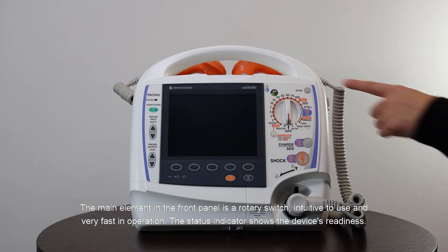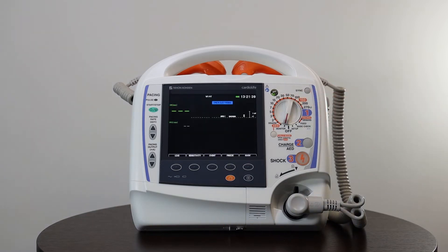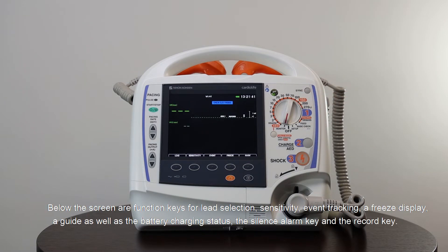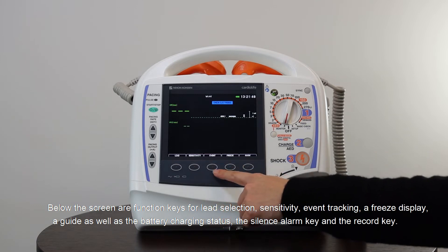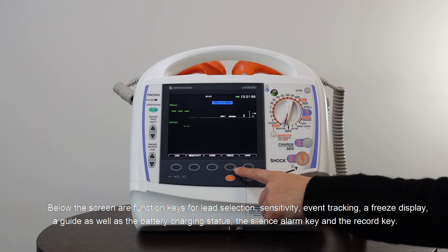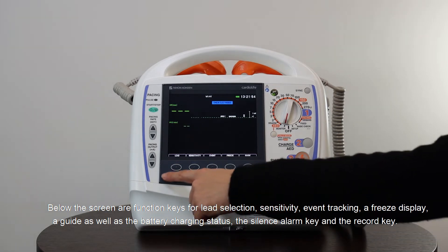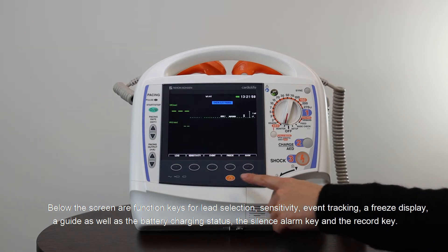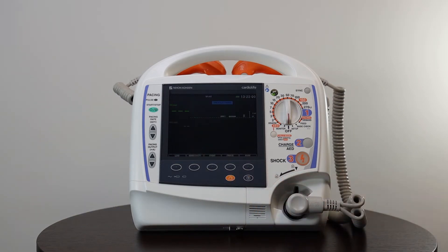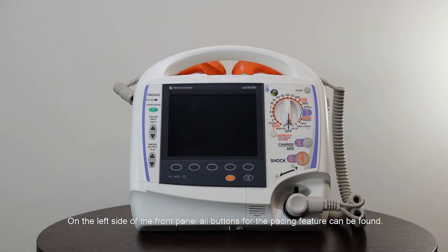The status indicator shows the device readiness. Below the screen are function keys for lead selection, sensitivity, event tracking, a freeze display, a guide, as well as the battery charging status, the silence alarm key and the record key. On the left side of the front panel, all buttons for the pacing feature can be found.